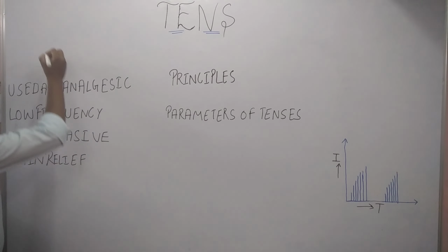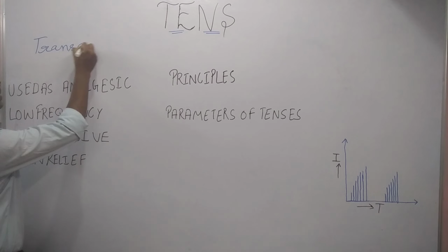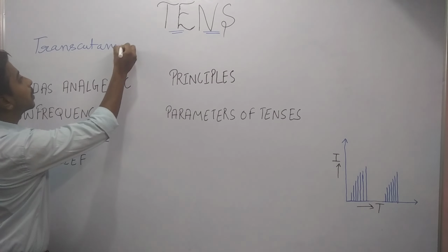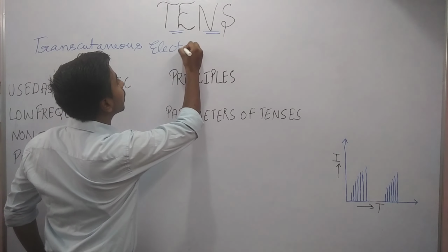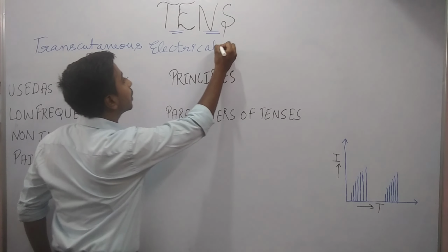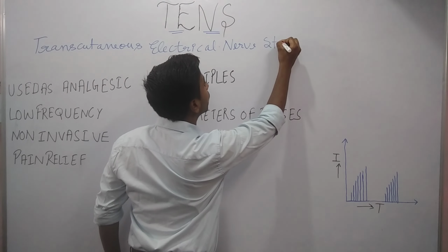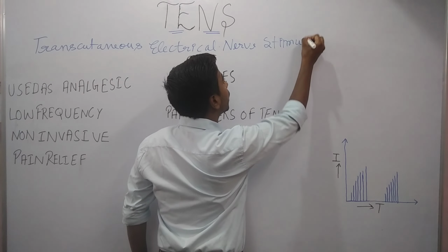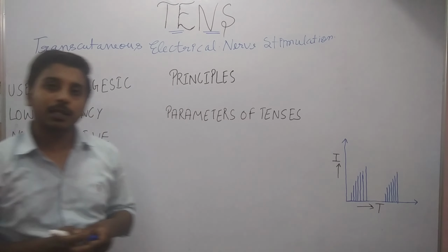What is TENS? TENS is expanded as transcutaneous electrical nerve stimulation. What is the meaning of this?